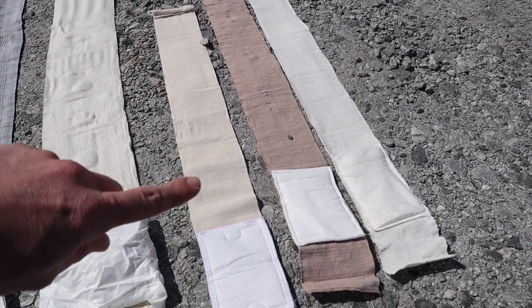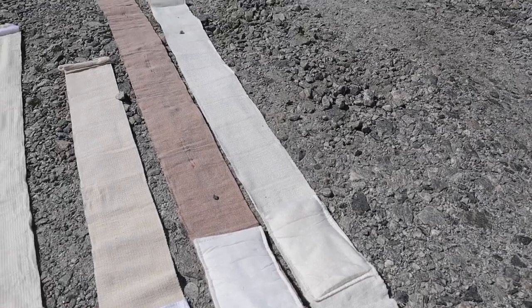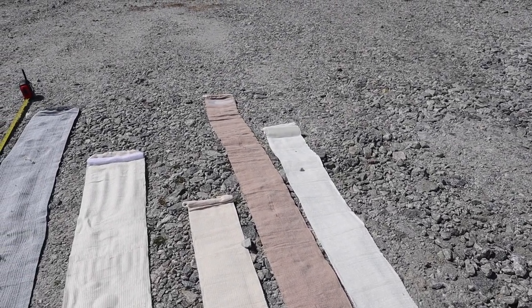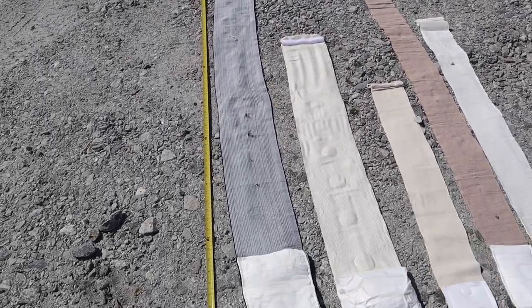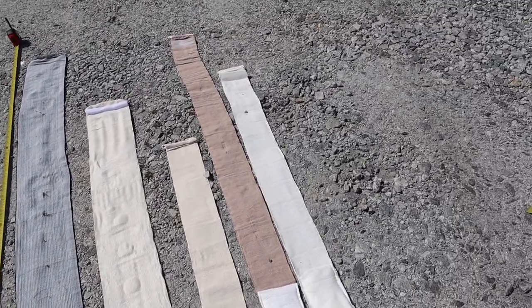This is the mini H one right here. This one over here, the tan one, is the NAR four inch flat fold. You can see it is almost the same length as the Israeli, but the NAR one is a four inch flat.